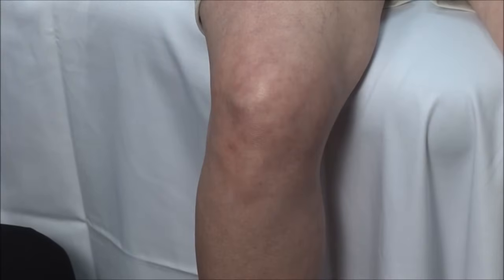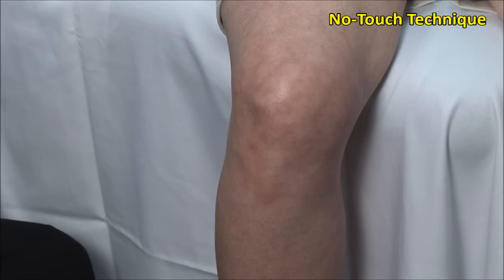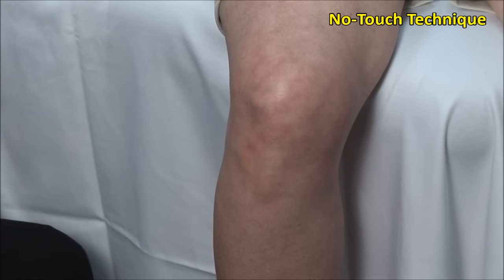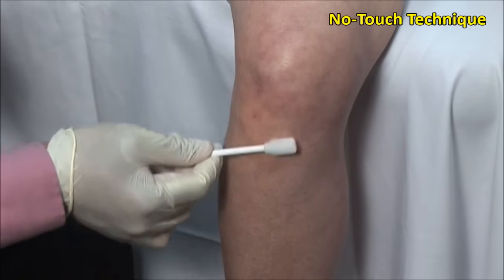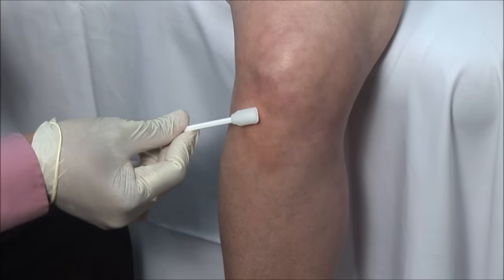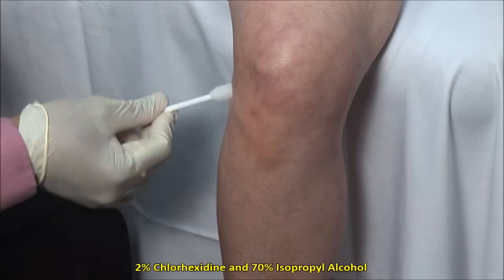These injections should always be done using sterile precautions. A no-touch technique is used, meaning that once the area is cleaned, it must not be touched with anything but sterile needles. Scrub the site and then clean in an outward fashion.